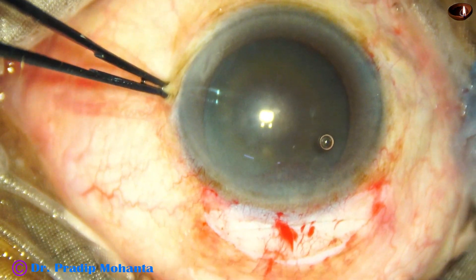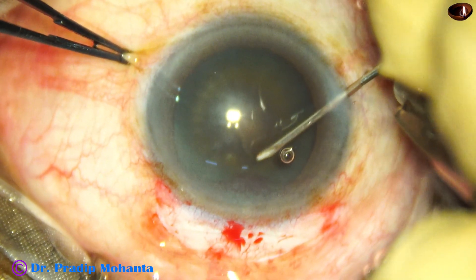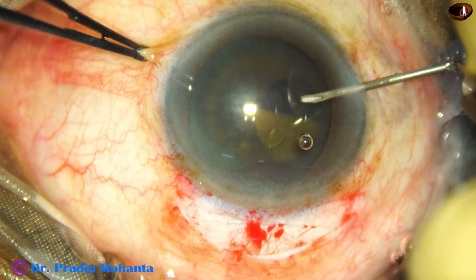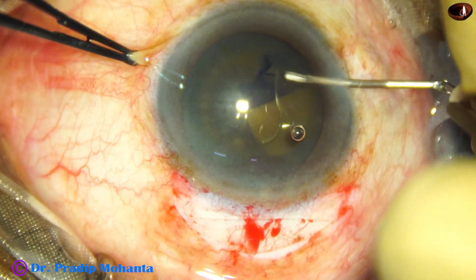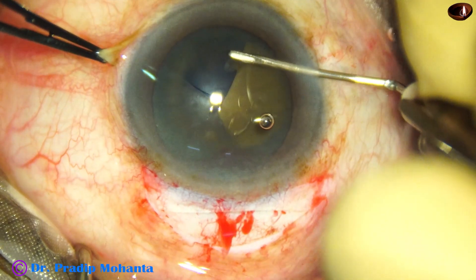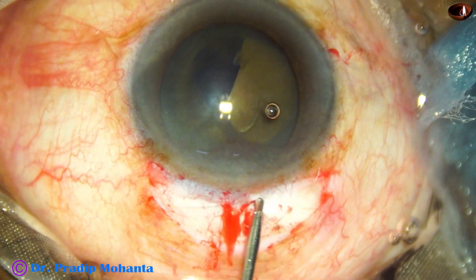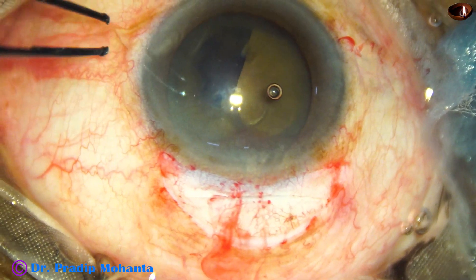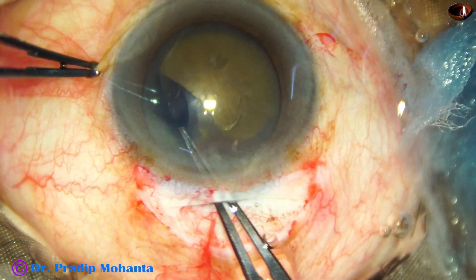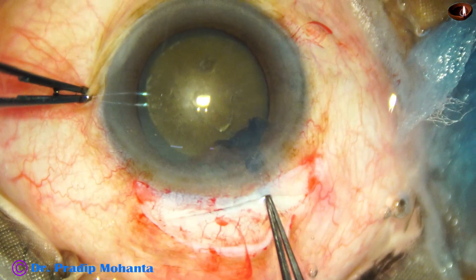Now I am going to do the capsulorhexis with this cystitome — a 26-gauge bent needle. Since the cataract is hard and the nucleus is huge, the rhexis should be large. The size of the rhexis should be 5.75 to 6 mm so that the nucleus can prolapse into the anterior chamber easily. Now I am using the utrata forceps to complete the rhexis. Almost half of it was done by the cystitome and the rest by the utrata forceps, and we have got an adequately sized rhexis.